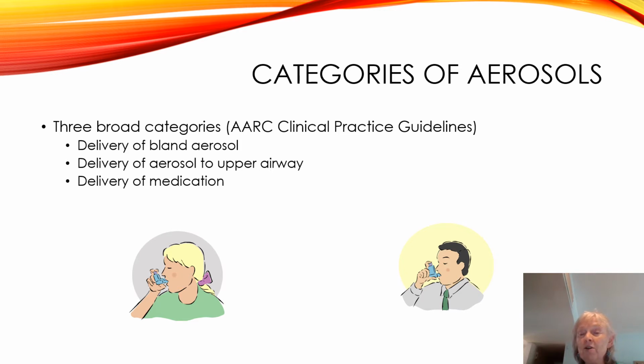This is quite a bit of change from what we used to teach folks in the back practice before. We used to tell patients that you didn't want to put the inhaler in your mouth. We were concerned about losing some of the medication on the back of your throat or the back of your airway. And so we would teach them how to do it without putting it in their mouth. Also, we would teach them how to do it with what we called a spacer or a holding chamber, two different devices that we still recommend. Since we had to change the carrier gases for some of our aerosol medications, the new carrier gases really don't have the oomph behind them as the CFCs did. Some folks were complaining that they were not getting their medication, they couldn't feel their medication, and as a result of that, there's been a change in the policies that we do actually let the patients put the MDI in their mouth.